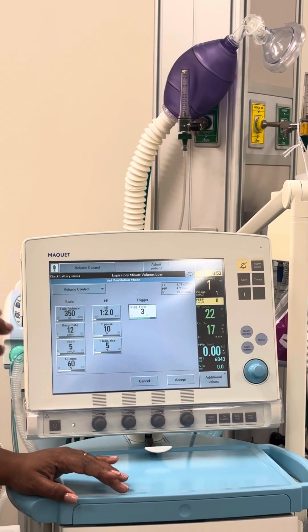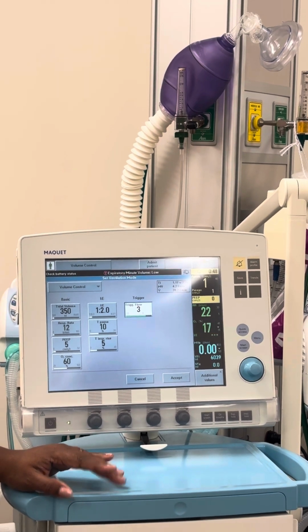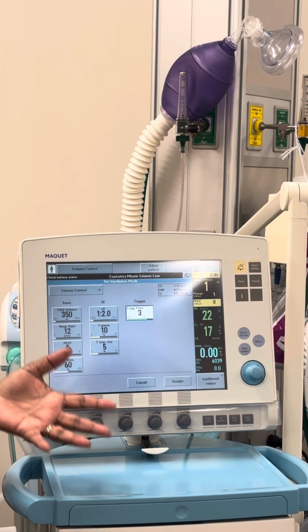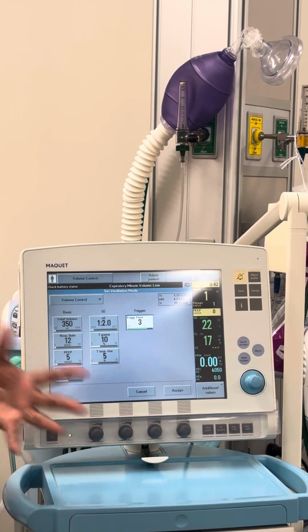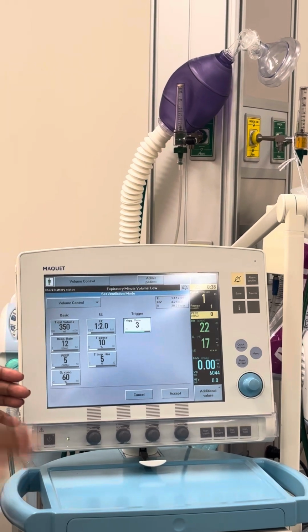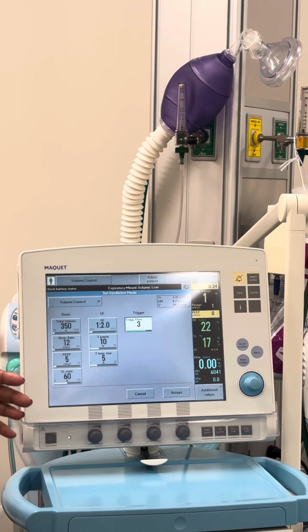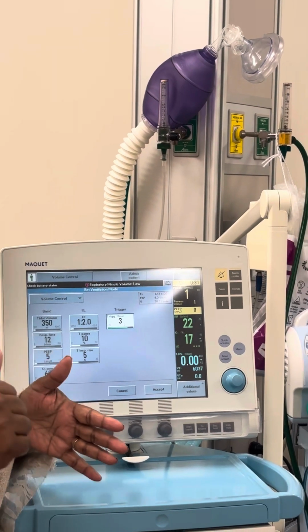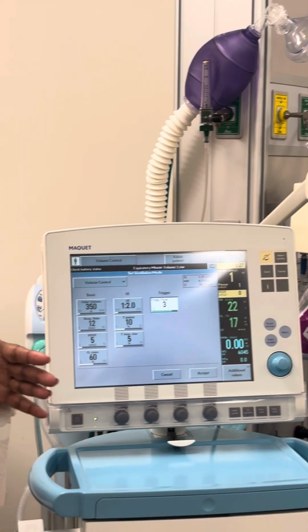So when you're checking off, depending on your ventilator, you have to make sure you have all 8 on here. You could tell me that you don't have ramp or flow rate to adjust, but you could tell me what your ranges are. Ramp, you want what kind of ramp? Did y'all call it gradual? I call it decelerating. What do y'all call the ramp? Decelerating ramp. Yeah, it's actually decelerating because then you have another one, a square.